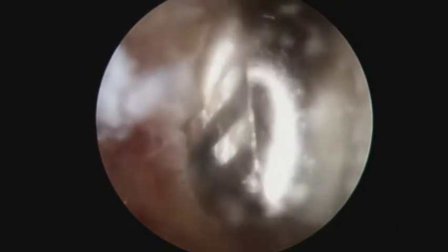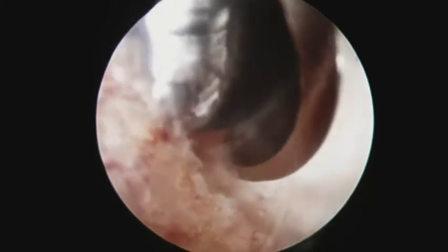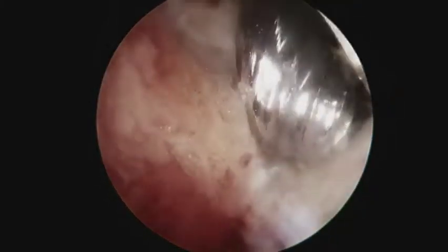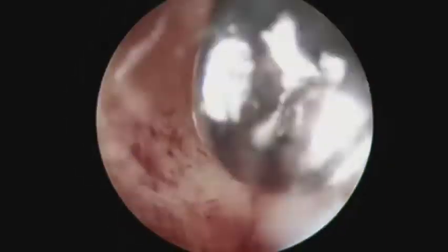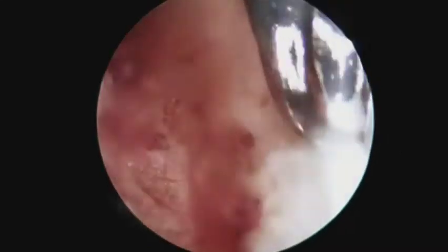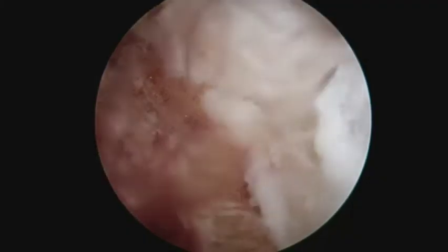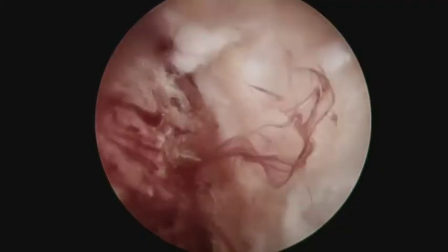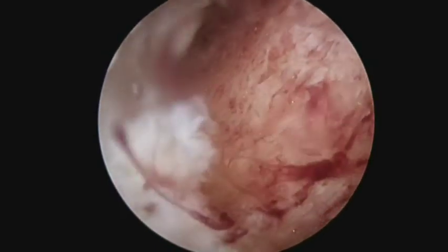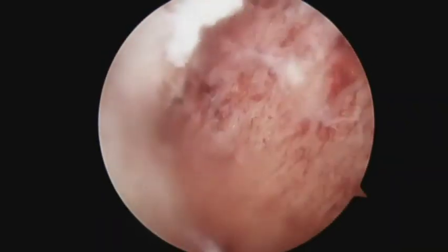The bone resection should begin at the Achilles tendon insertion and then progress proximally in order to avoid accidental detachment of the Achilles tendon. After completion of the endoscopic calcaneoplasty, the Achilles tendon should be reassessed to confirm there is no more impingement by the posterior calcaneal tuberosity.